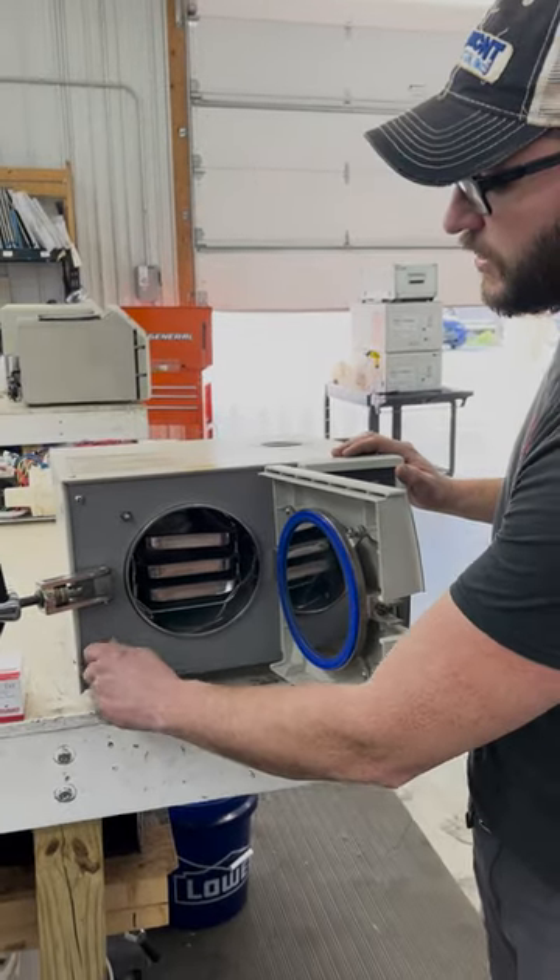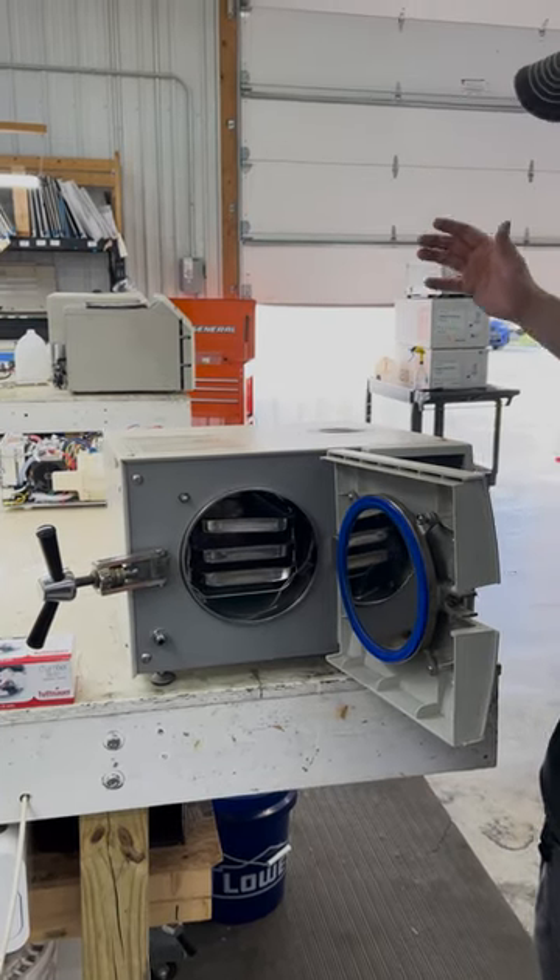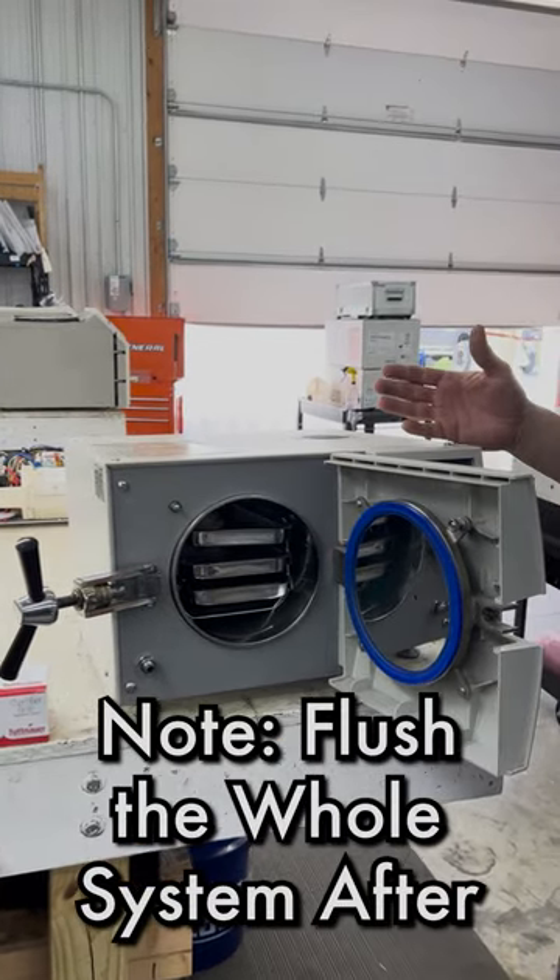To drain these units, you turn this knob counter-clockwise, and we always recommend flushing the whole system out afterwards as well.